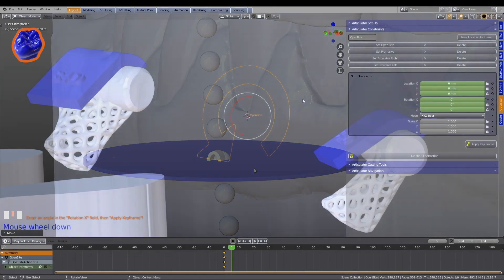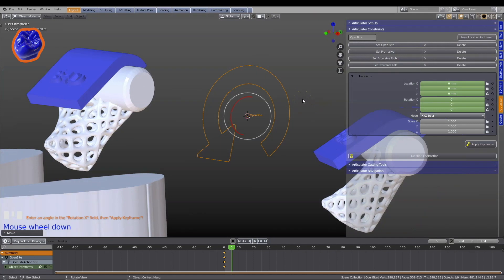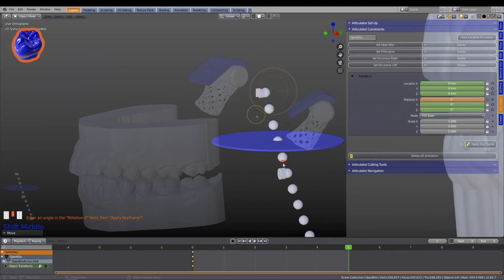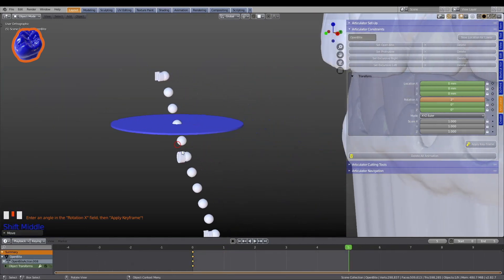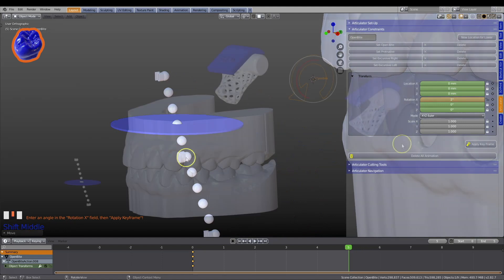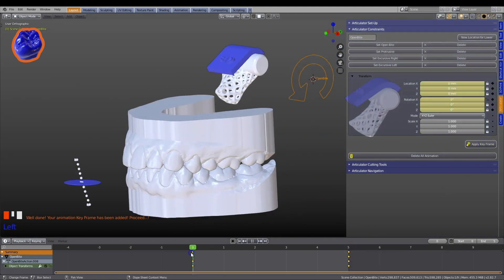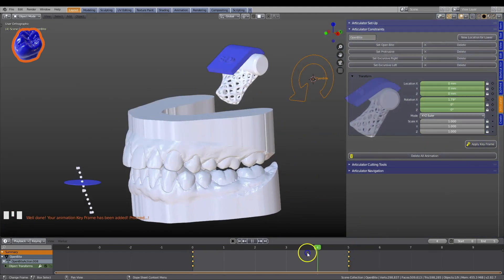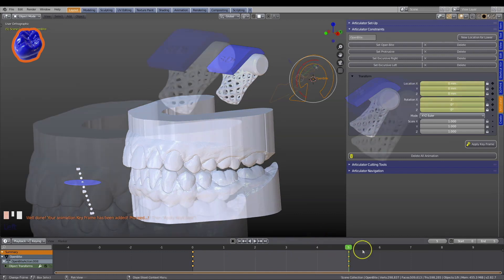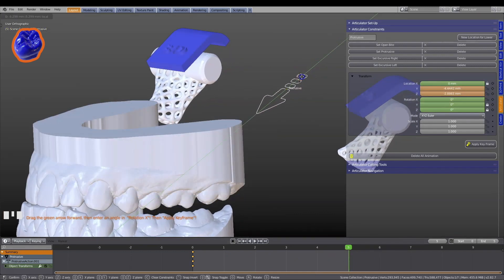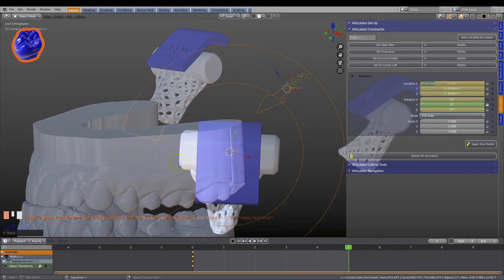Learn from easy-to-follow tutorials. Set your excursive bite positions, then animate the lower jaw.